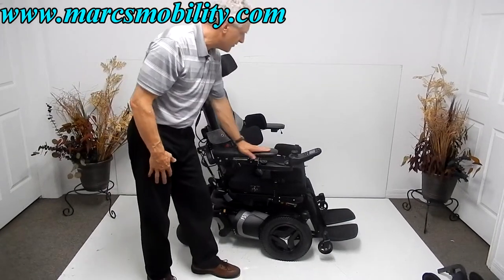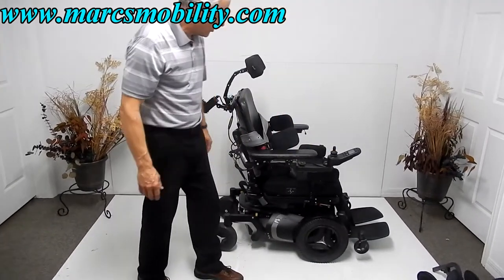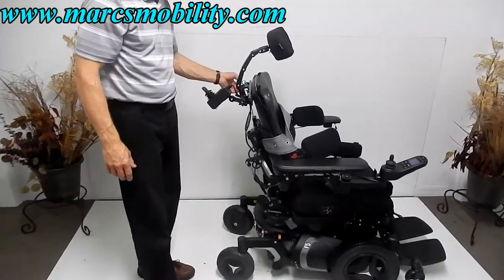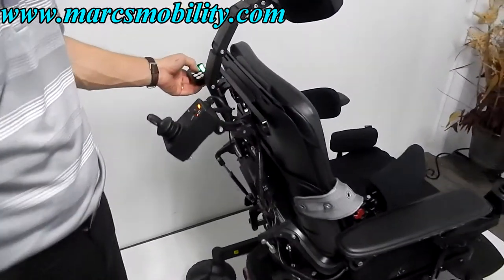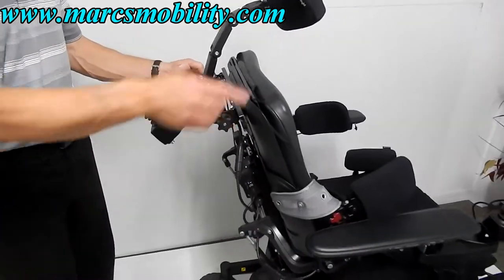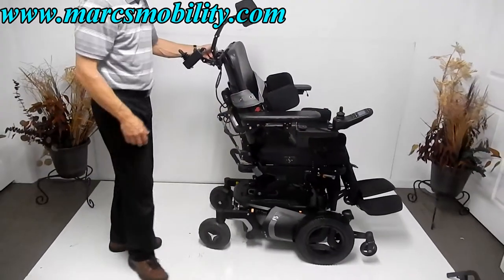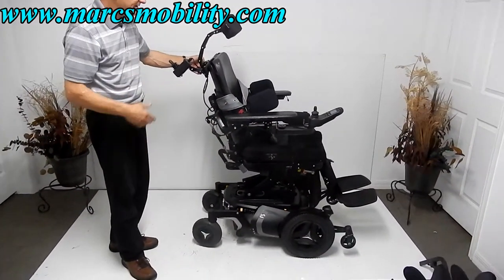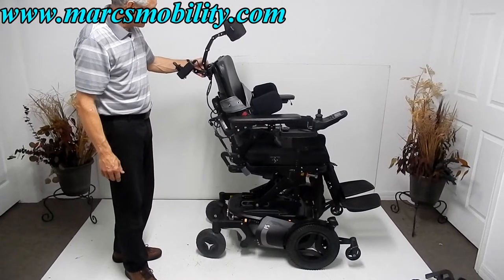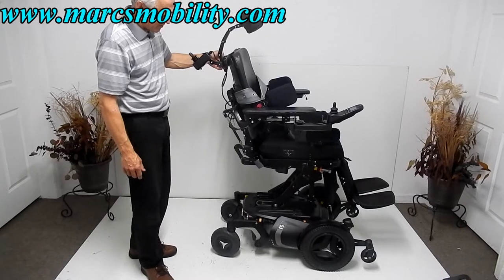Now I'm going to move the chair forward and demonstrate the electric 14-inch seat lift, working it from the control box in the back. This box can be moved behind the joystick if needed. The person who had this chair had a back picker and did a lot of the driving from behind.